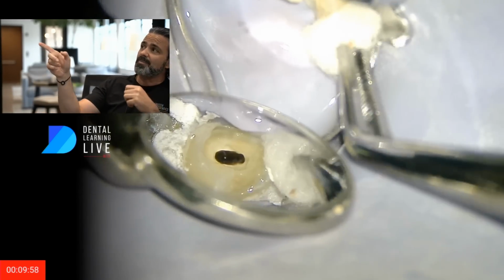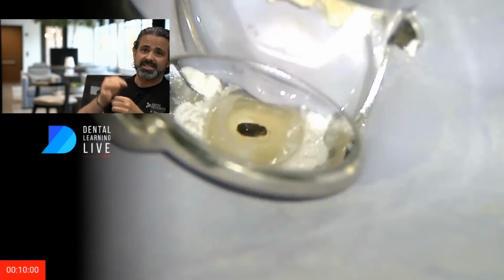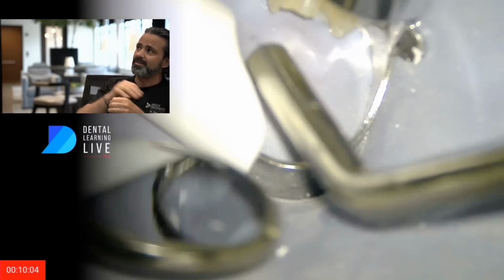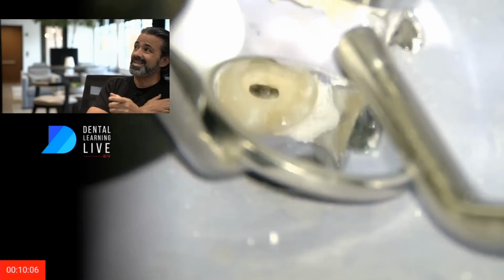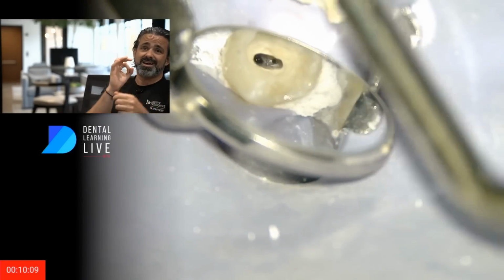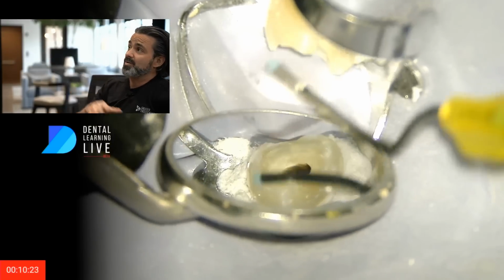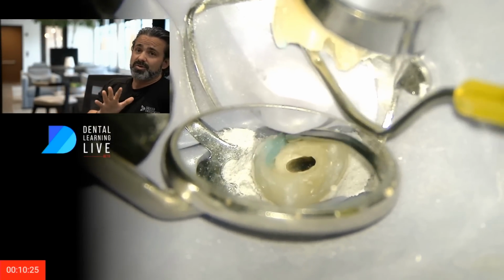So you saw me fit the matrix in there, just seated it on. I wanted to make sure my opening and the pin placement of the matrix can actually be seated in there. And then I take a cotton ball that's saturated in isopropyl alcohol, and I'm just putting it in and around the tooth and blowing it dry.